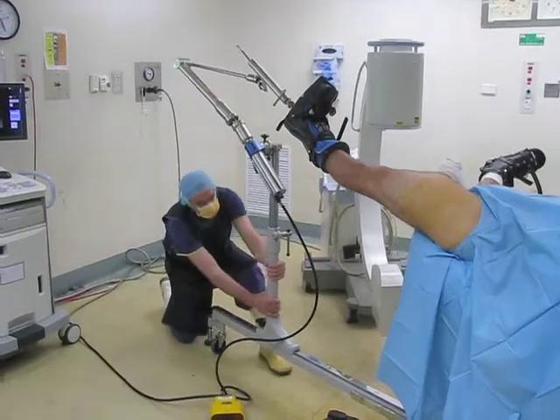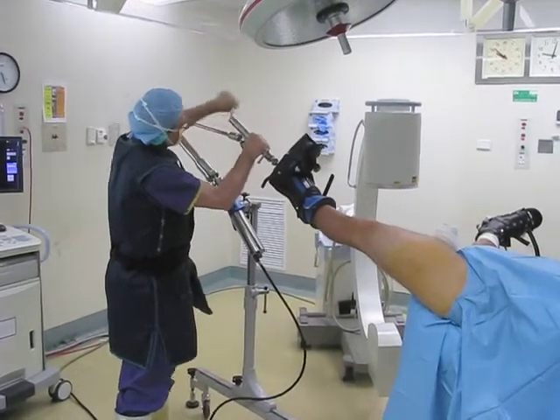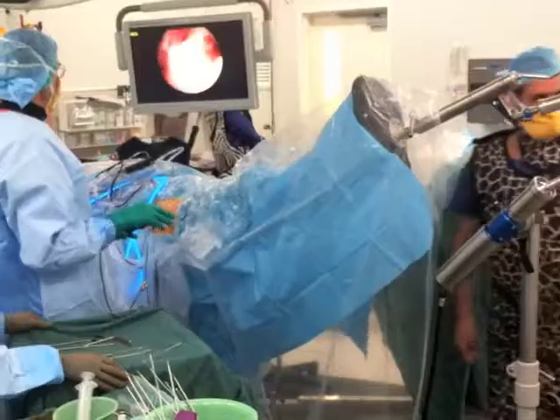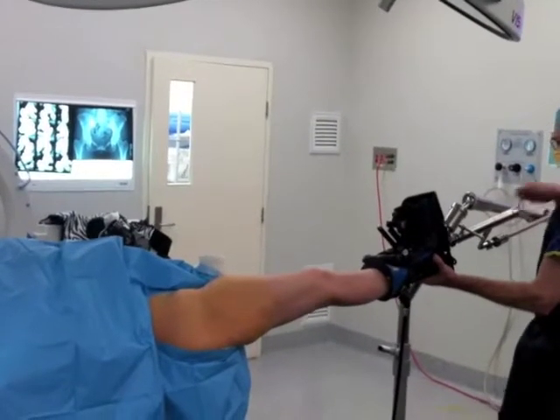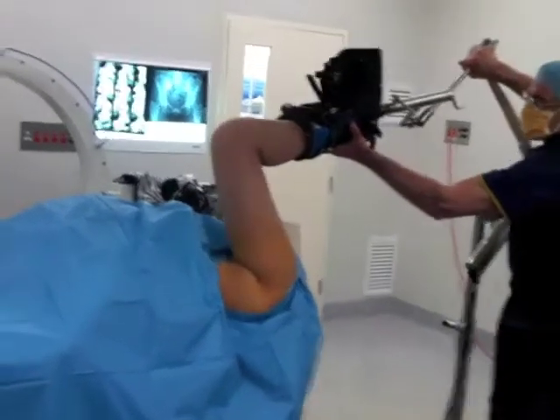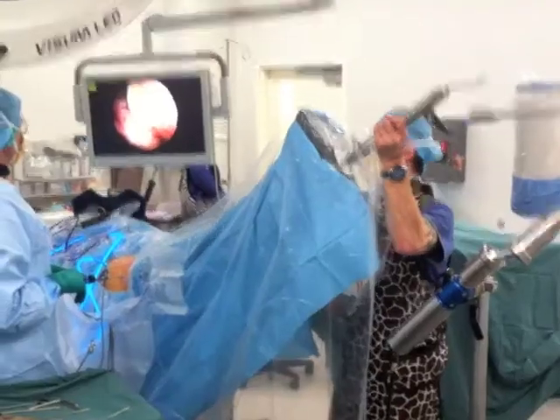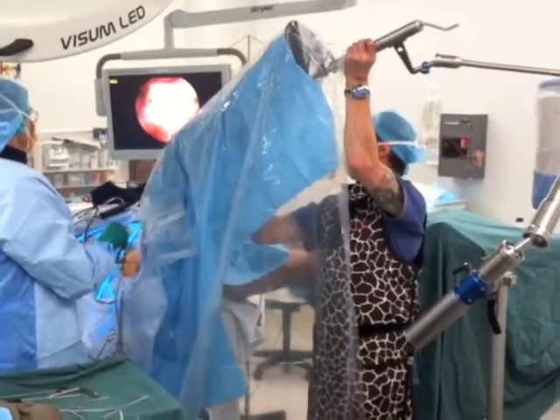The operated limb is brought into hip extension starting position and traction is applied. Once central compartment work is complete, the hip is taken out of traction and can then move through the desired range of motion. An intraoperative view of the hip brought into deep flexion.